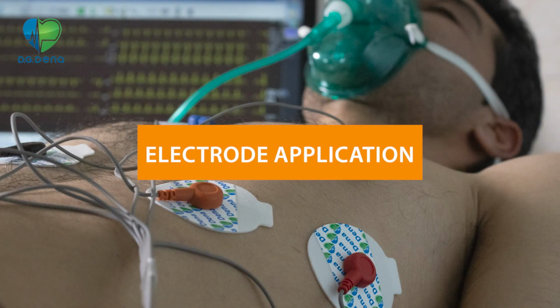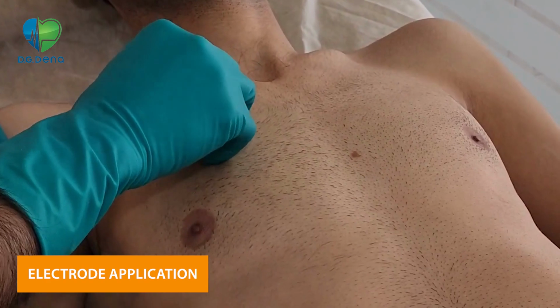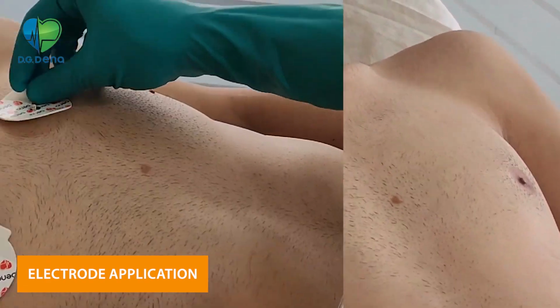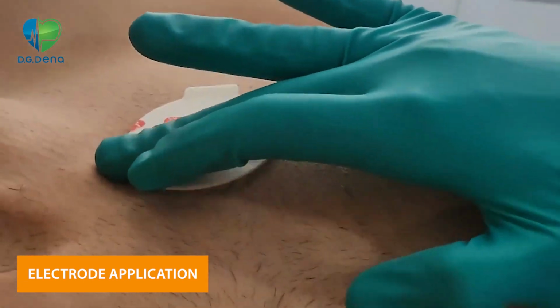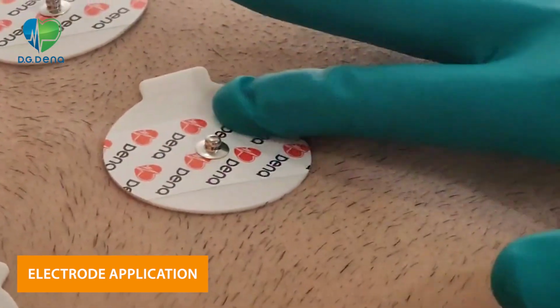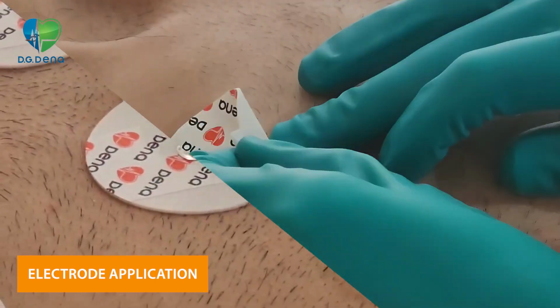Electrode application. After preparing the skin, remove the protective liner from the chest electrode and place the electrode on the prepared site. To ensure proper adhesion, activate the pressure-sensitive adhesive by rubbing your finger around the electrode in a circular motion. Repeat this process for each electrode. This technique helps produce a stable, high-quality signal.